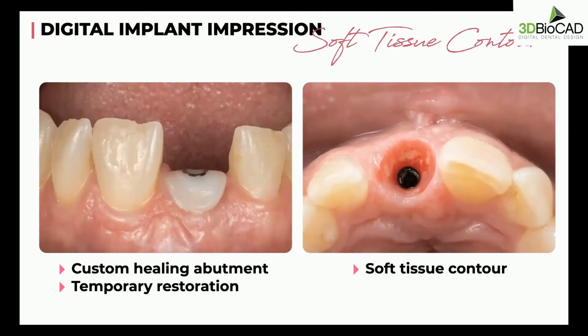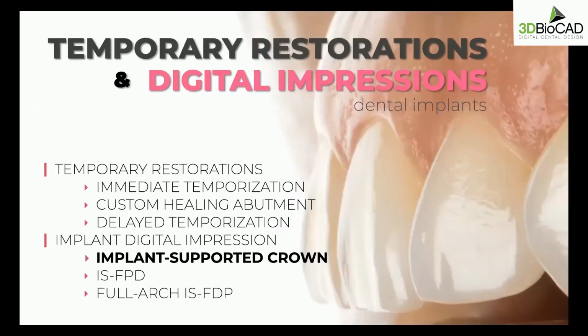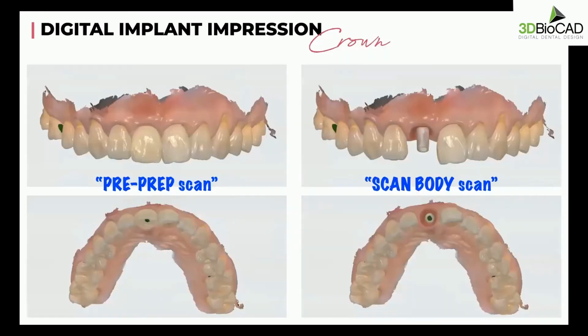It doesn't necessarily transfer that soft tissue contour very accurately if you just use an intraoral scan inside the mouth. So I'll just go over a technique that I use to transfer this information for an implant-supported crown. If you look at this case, when I do the scanning, I click on the pre-prep scan in the order form.